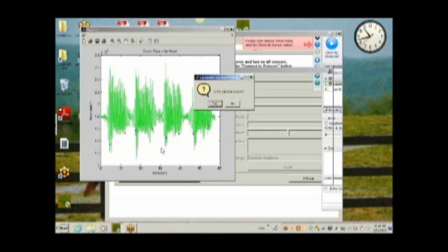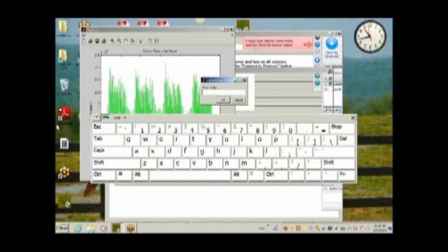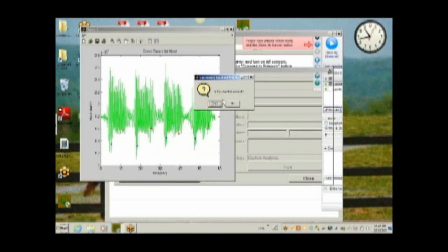And you can see here that a few additional strides at the beginning of each segment and at the end of each segment were included. If you would like to decrease the amount of strides included in the analysis, you will select no and enter a delta value less than 0.1, such as 0.08. And now you can see that the very first stride of each segment and probably the last 1 or 2 were eliminated from the selection.